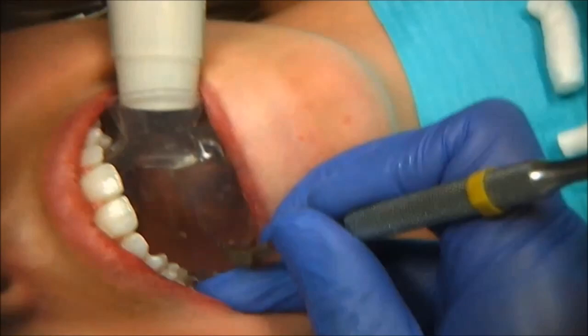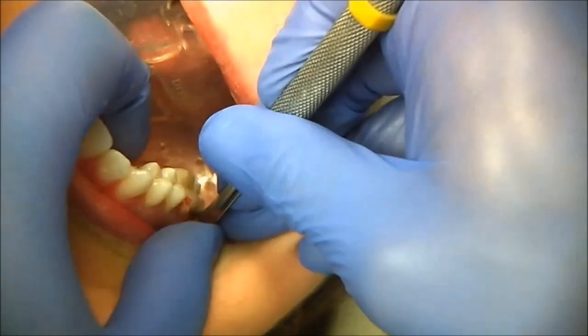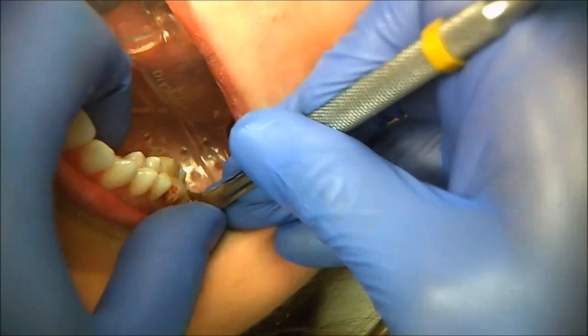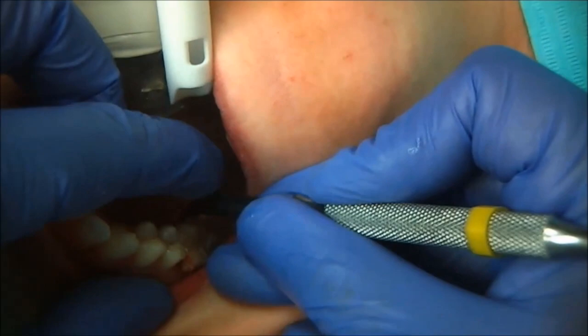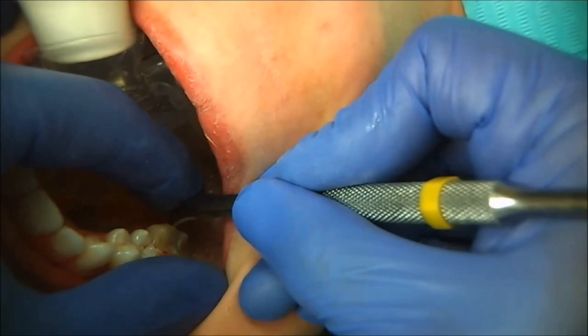The final trick is utilizing the number 12 blade to remove the cement using a two-handed technique. In the mouth, a number 12 blade used with one hand can be a little dangerous if it slips. On the screen you see me using two hands: one hand is a fulcrum, the second hand applies the force. Done like that, you have absolute control — nothing scary about it. A number 12 blade does a much better job than a scaler, because a scaler takes chunks out of the margins and you end up with slightly open margins. The number 12 blade simply planes or trims the cement, and it works incredibly well.